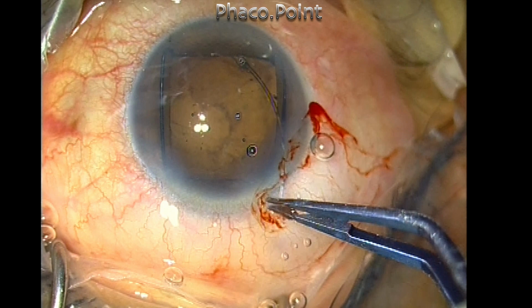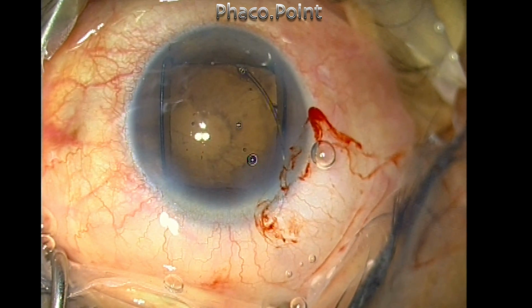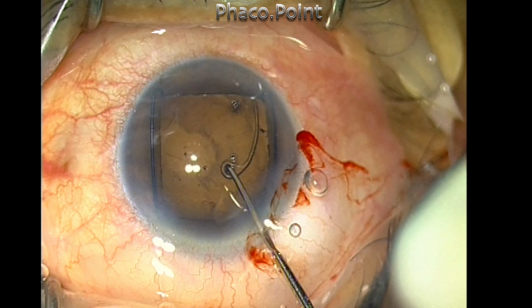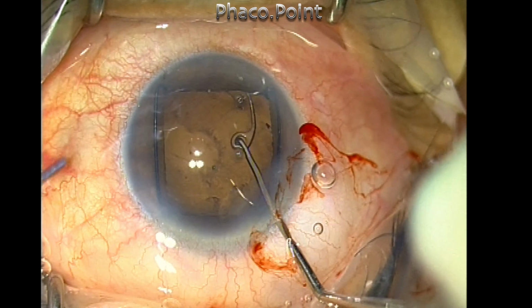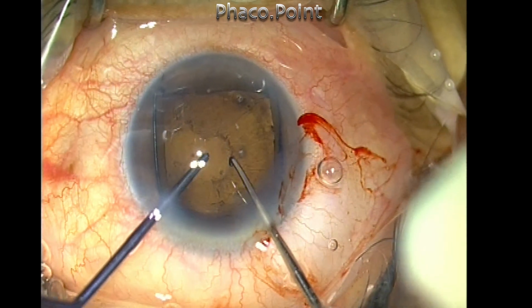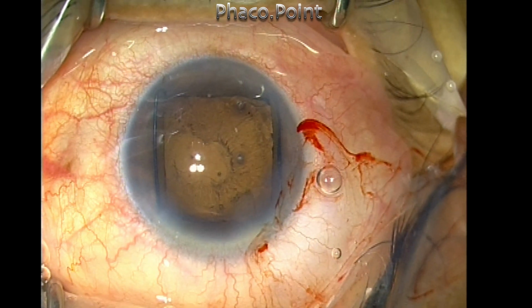bag. Now when you put the trailing eyelet inside the eye, it can be done with an intraocular forceps, or I prefer to use a Sinskey hook. Make sure that you engage the eyelet properly with the Sinskey hook so it does not slip. Then it can be released with the help of a second instrument, which could be an iris repositor.